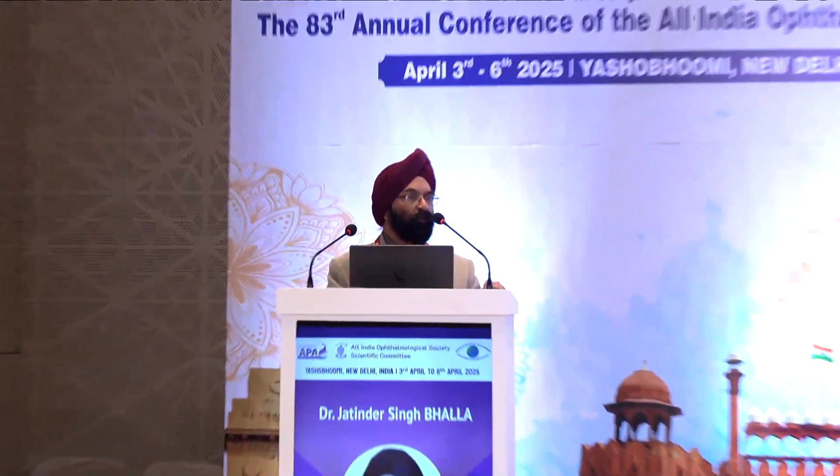Yeah, here the most important thing is estimation of the keratometry. For keratometry, I think here you require corneal topography, you do Scheimpflug testing so that you have the accurate power and the axis, and then you can feed in your data.